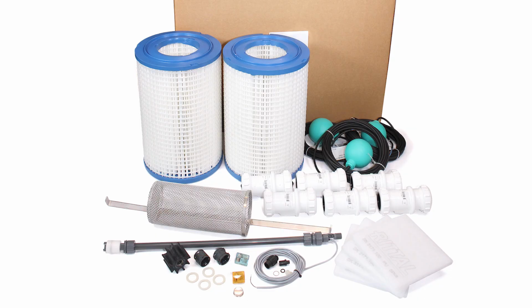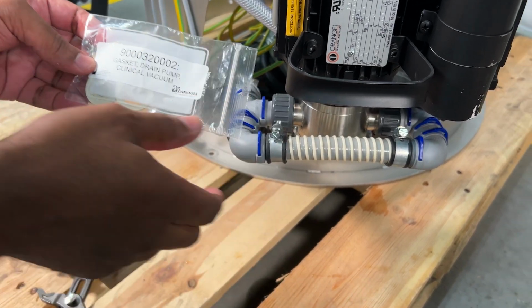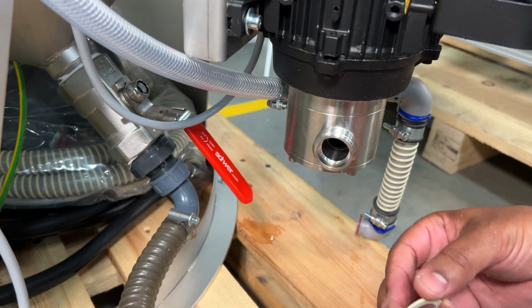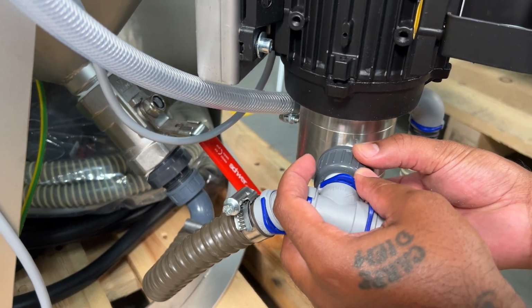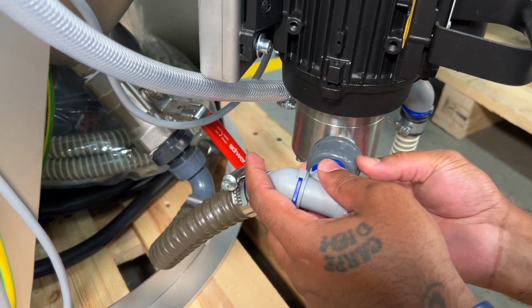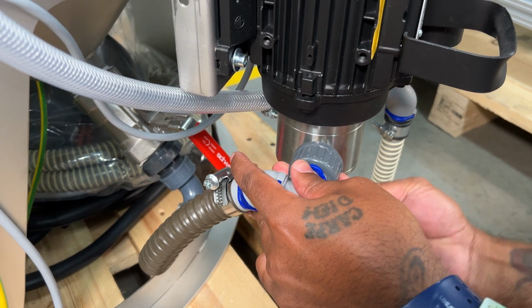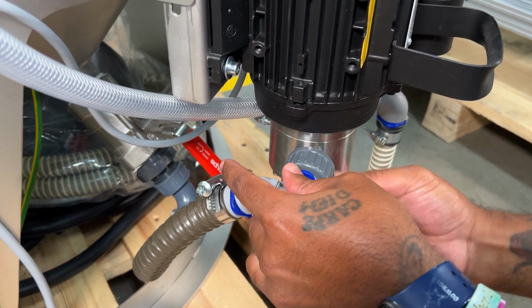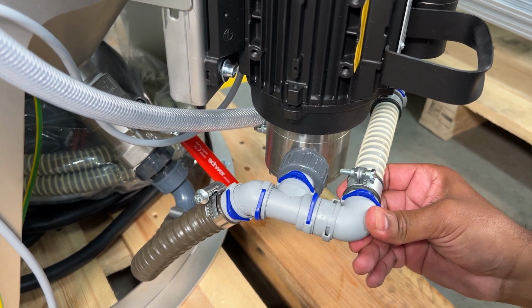Retrieve the replacement gasket from your maintenance kit, part number 9000320002, ensuring it matches the specification of the old one you just removed. Replace the gasket. Screw back the gray compression nut. Place the blue fitting back.